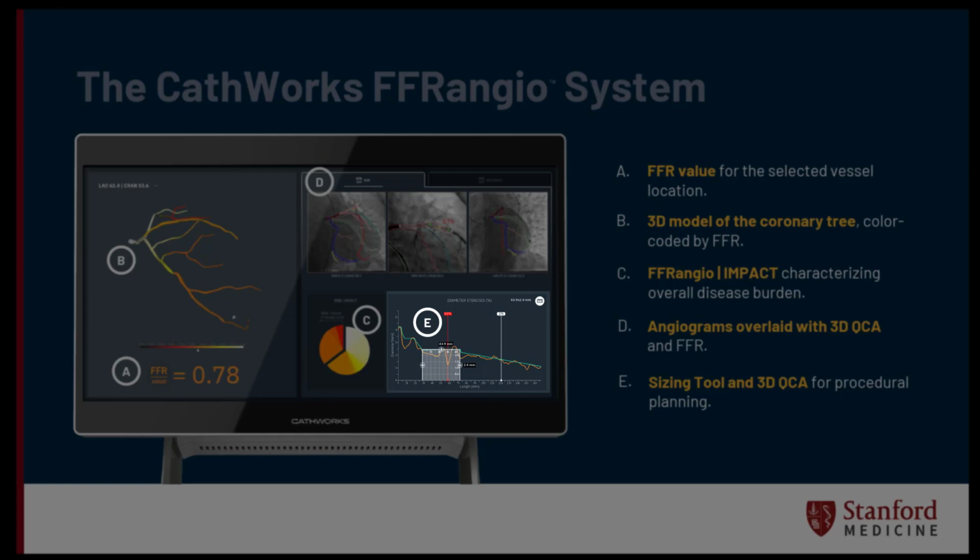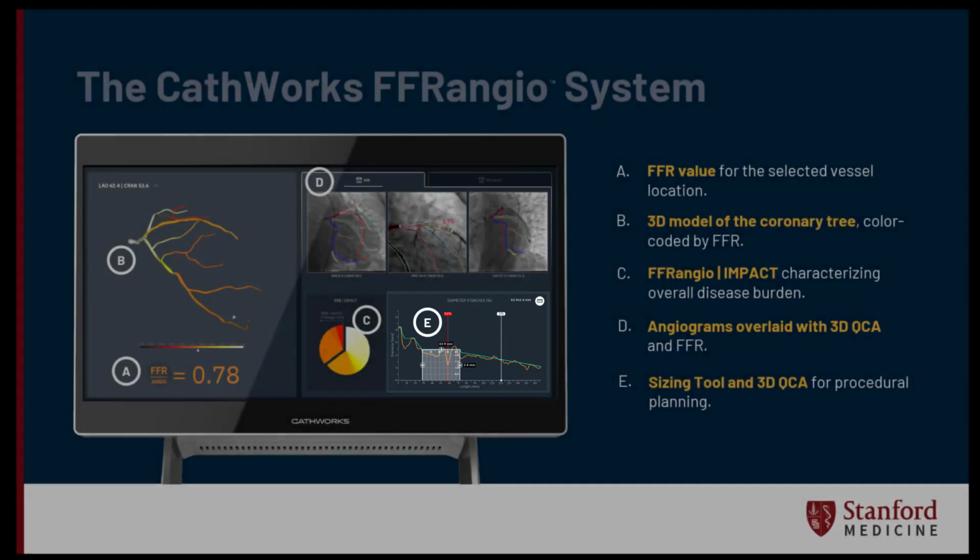And this is incredibly useful because, as we know, our naked eye is not good at assessing the size of stents. We often underestimate the size of stent. We often underestimate the degree of expansion. And certainly a lot of studies show we miss the entirety of the lesion length. Now we have a physiological, hemodynamically governed way of sizing not just the diameter, but also the length of stent to be treated. So it's sort of the next step in appropriate PCI.